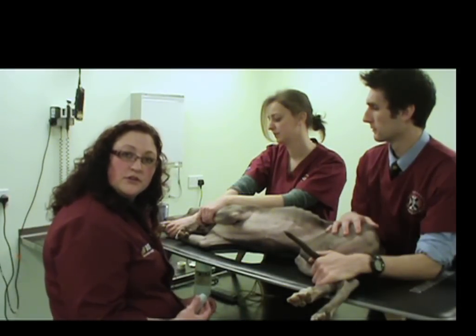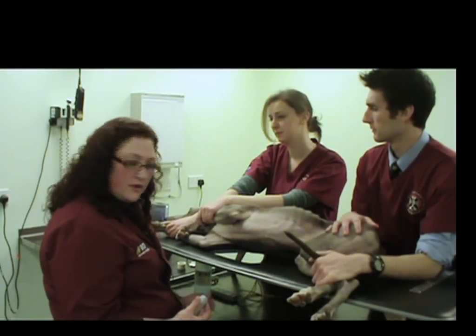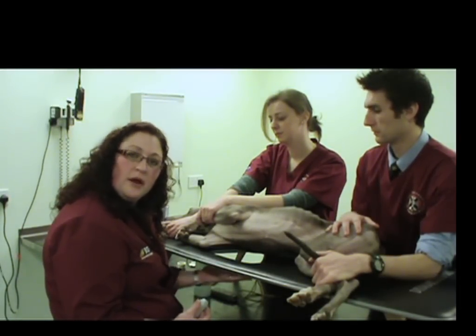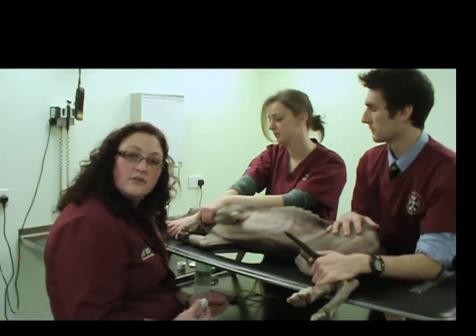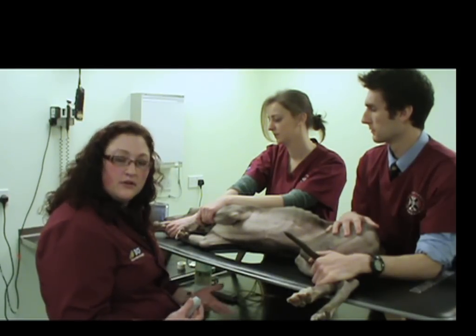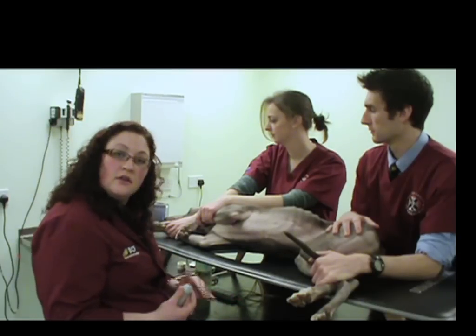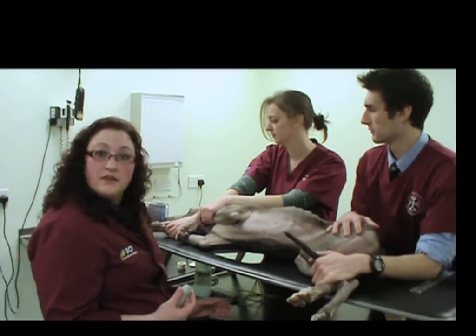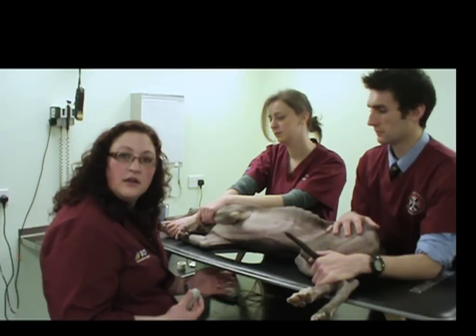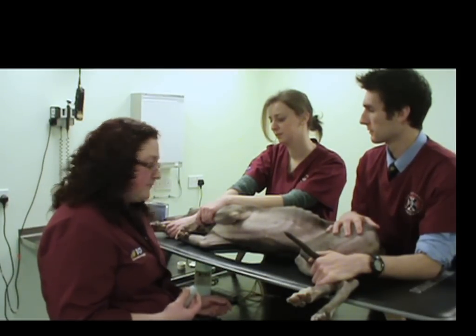The next standard view we'll look at is the short axis views, still from the right and still from the parasternal location. These will now be the right parasternal short axis views. We'll be cutting the heart basically into a cross section and looking at it at various levels, and we'll look at how to do that just now.